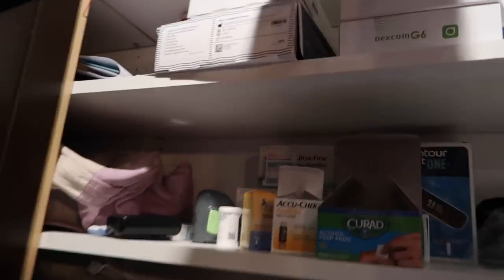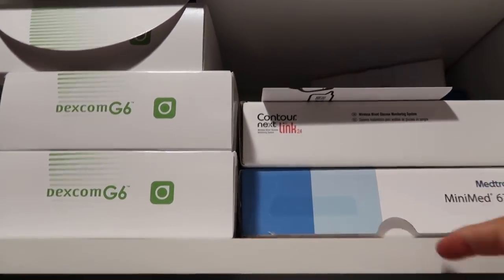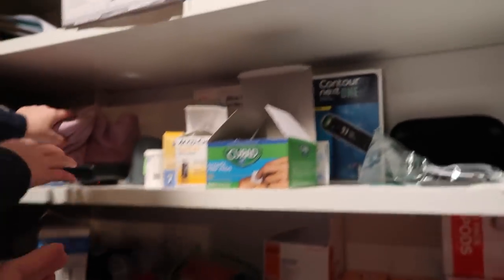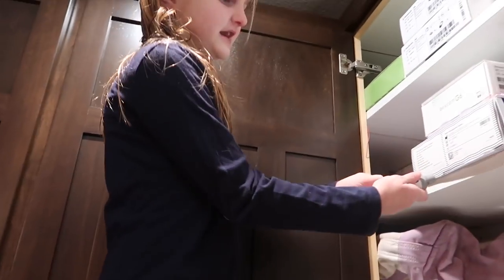This is just the transmitter box that the Dexcom came in. And then these are our Medtronic Mini Med boxes that we keep — we just keep them up there just in case. Then we'll go over here.